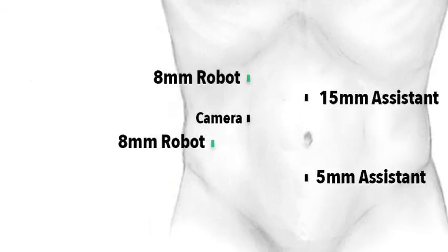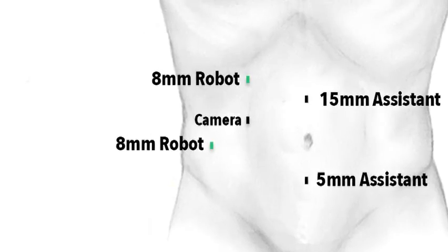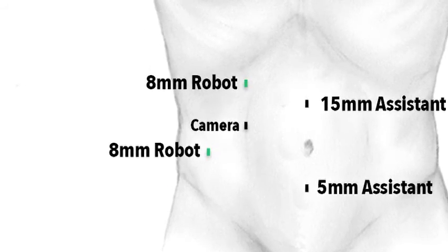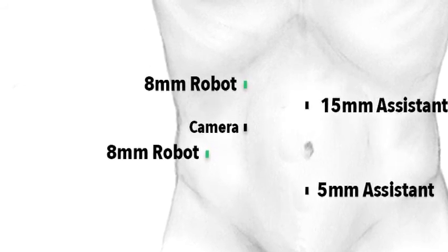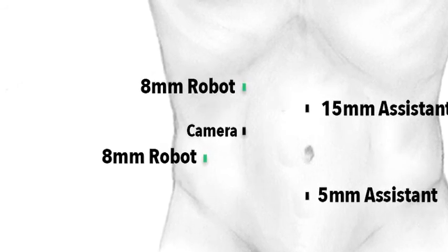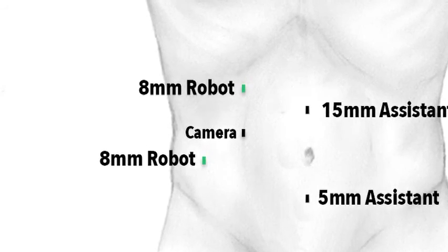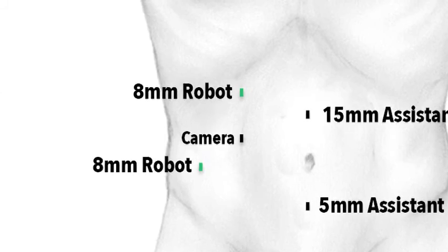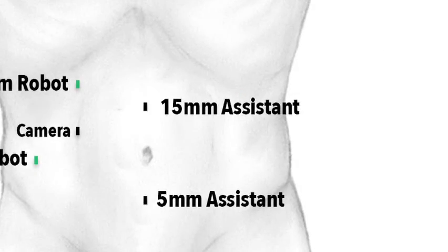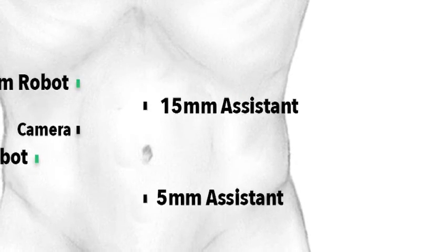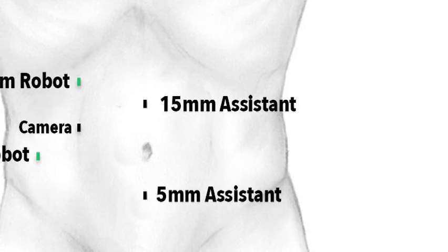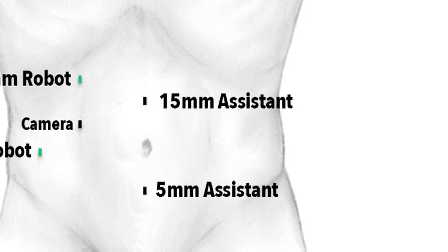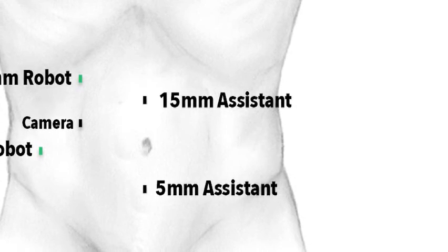Trocar placement is demonstrated with the camera port shifted laterally, with bariatric robotic trocars placed at least 8 centimeters apart to help minimize robotic arm collisions and maximize the working space for the bedside assistant. A 15-millimeter and 5-millimeter assistant port are placed in the midline, midway between the umbilicus and xiphoid and infra-umbilically.